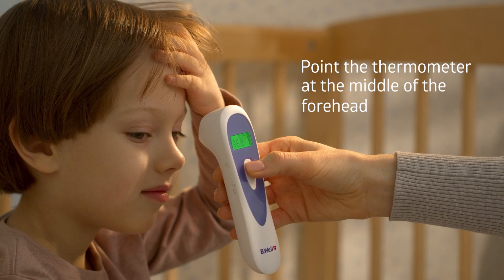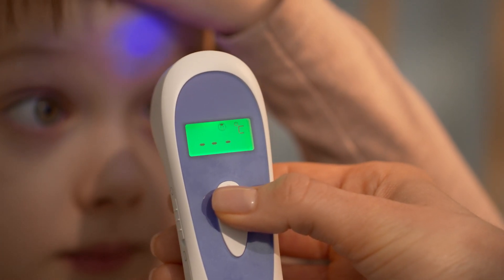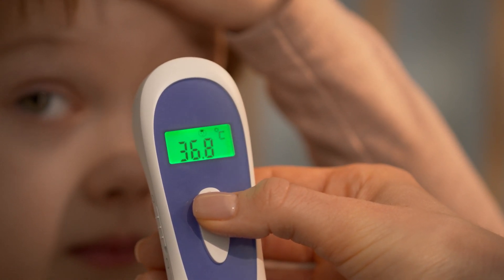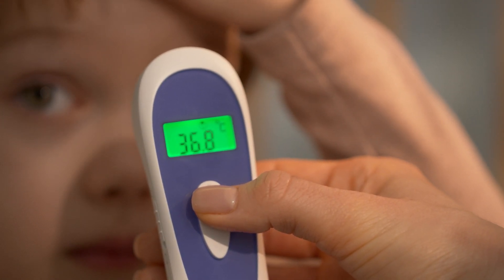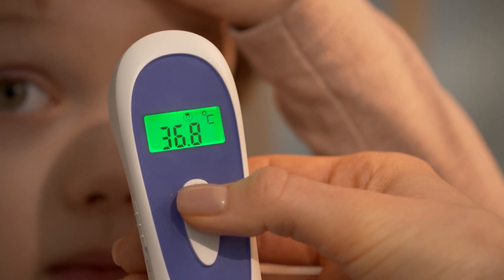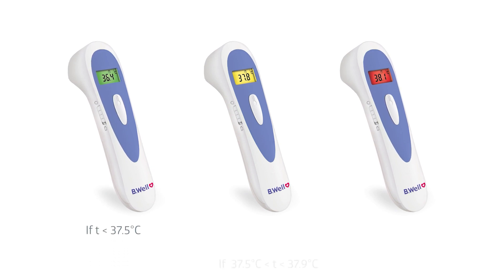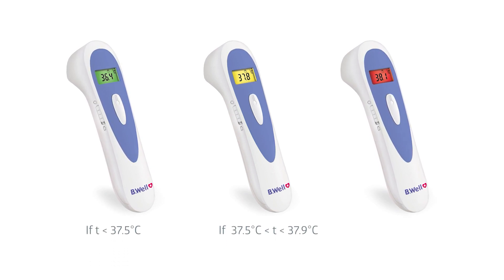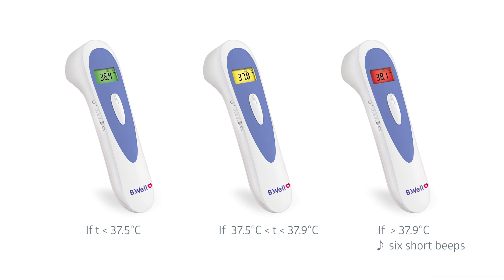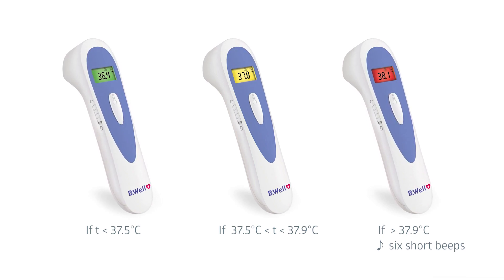Hold the thermometer 3 centimeters away from the forehead. The tracking light will help place the sensor accurately. Press and release the on/measurement button. You will hear a short beep indicating that the measurement is complete. The temperature will be displayed on the screen. The color of the backlight depends on the temperature measured. If the temperature is above 37.9 degrees, the display will turn red and six short beeps will sound.